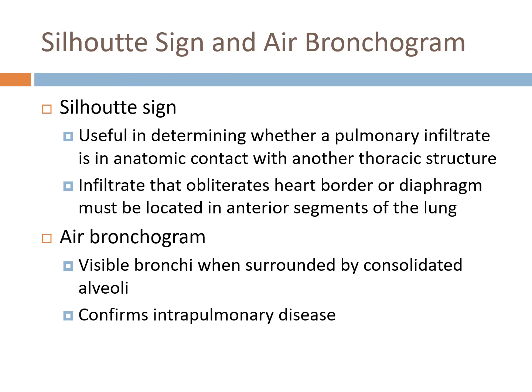So normally there's a significant difference in the density with sharp borders in the mediastinal-like area. So you're able to tell the difference between tissue and maybe an infiltrate and bones. But in the lung tissue, especially around the heart or the diaphragm, sometimes it's hard to differentiate.